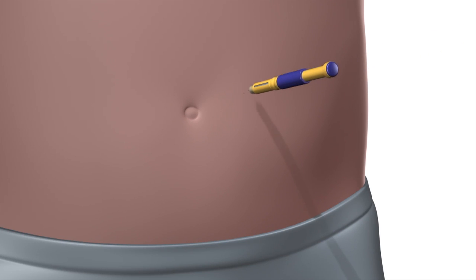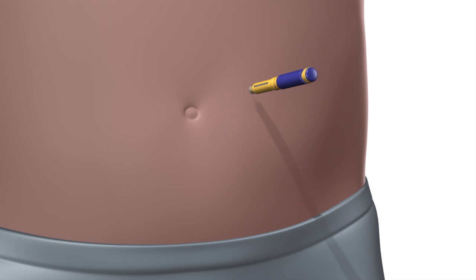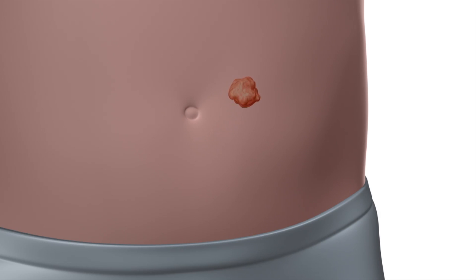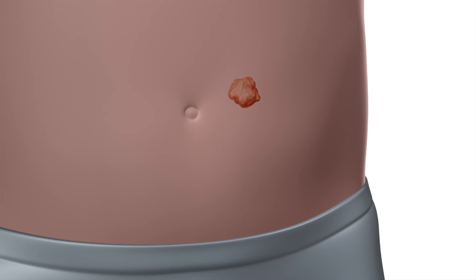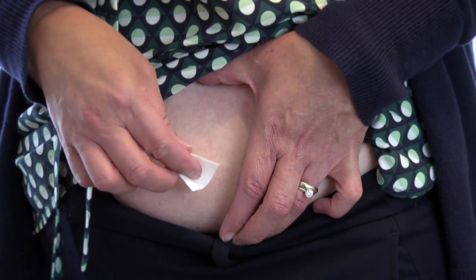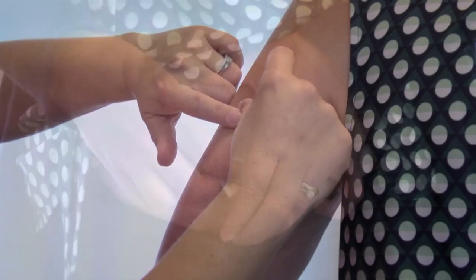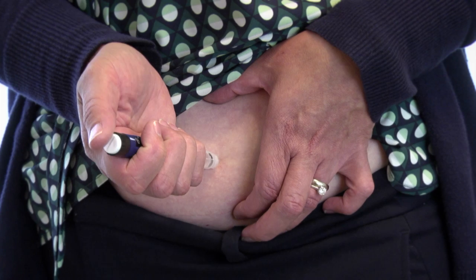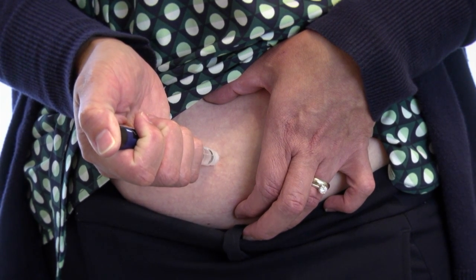If you use the same injection site over and over again, you may get hardened areas under your skin that keep the insulin from working properly. Rotating your injection sites will make your injections easier, safer, and more comfortable. Ask your health care provider which sites you should use. Clean an area of about two inches of skin in a circular motion with an alcohol wipe. Move the site of each injection — inject at least one and a half inches away from the last spot where you injected. Try to inject in the same general area of your body at the same time each day.